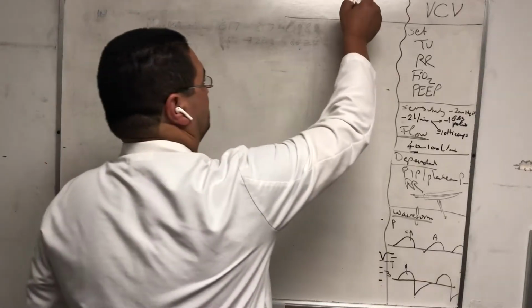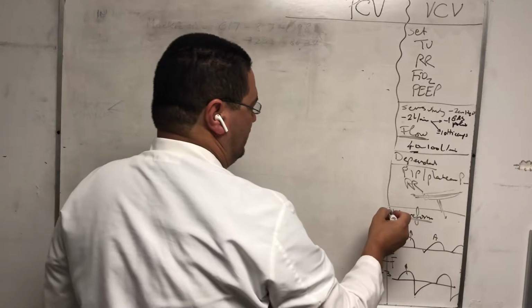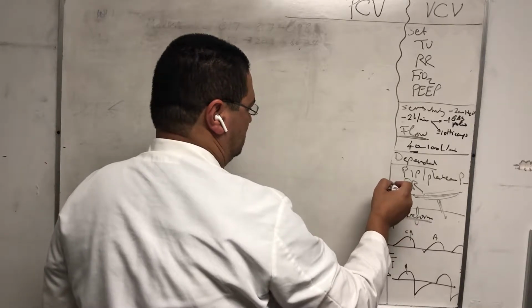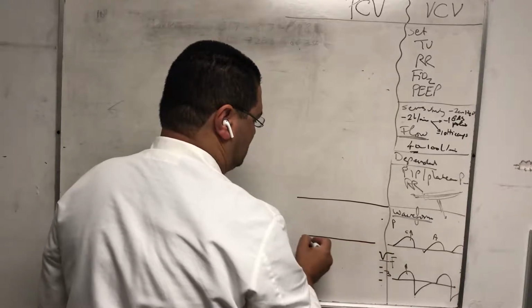All right, we're talking about pressure control. All right, PCV. So I'm going to start with the waveform. I'm going to start writing it here, over here. The waveform. Why am I starting with the waveform?